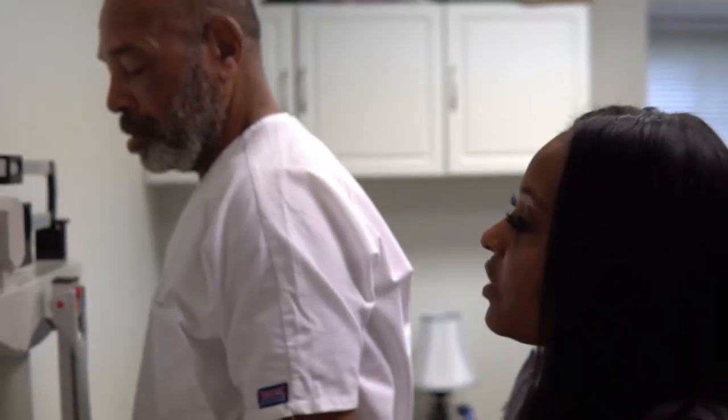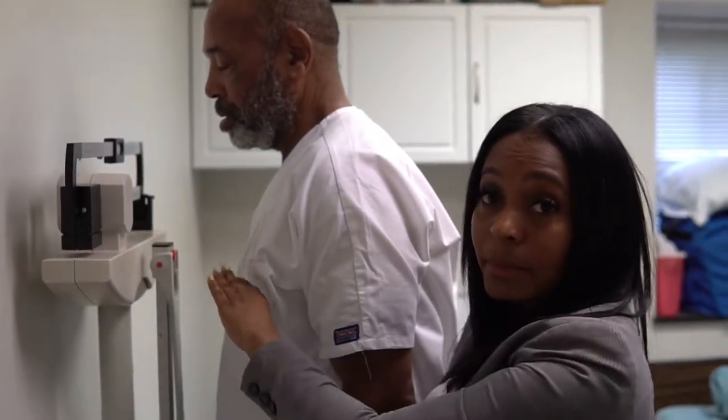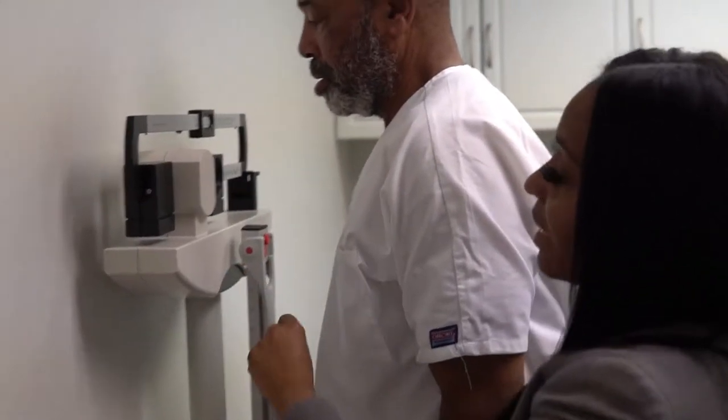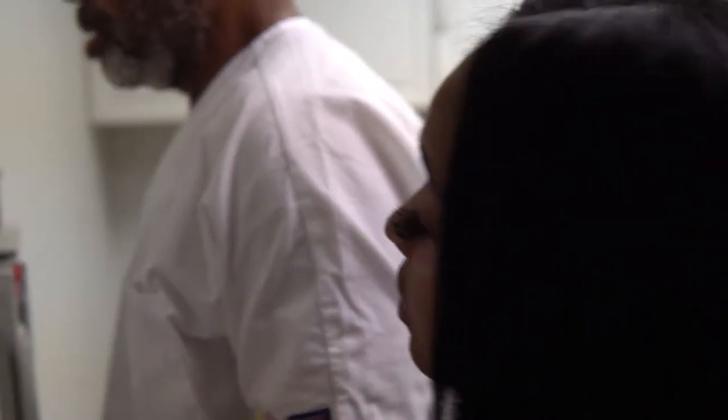Once we've achieved that, we want to add the bottom number to the top number. Our bottom number is at 160 and our top number is at approximately 7, so we add those two together and we get 167 pounds. You state that out loud.